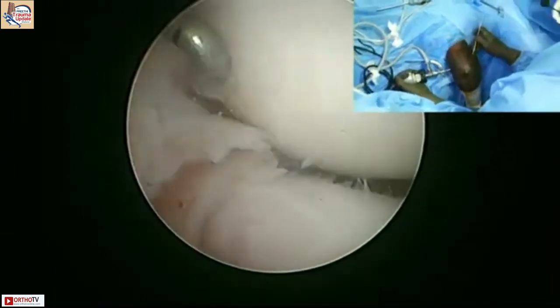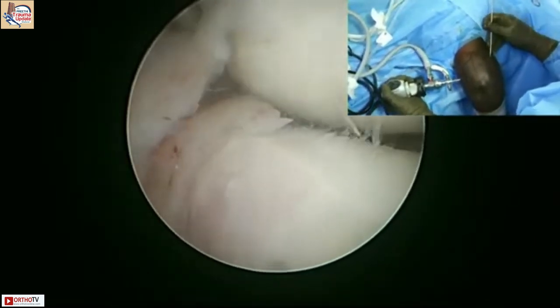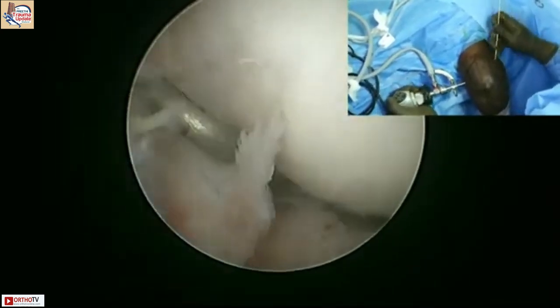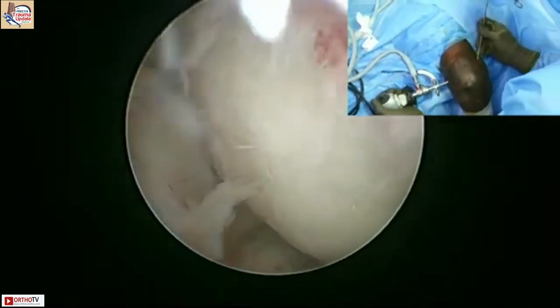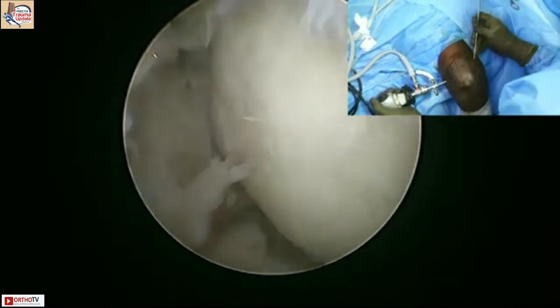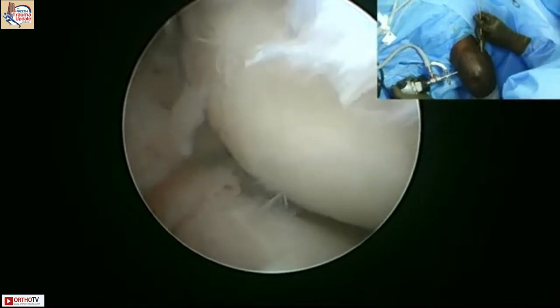Okay. So you see that piece of bone there? If you look at their scans, they have a little fracture there, and this is this muscle, the front of it. You see this white bit? Sorry, I am making you seasick. See that white bit? Where my tip of the probe is? Yes, we can see that. So you need to shave that off, right? To see the exact proper belly of the... This is ECRB. Part of the internal attachment of ECRB.